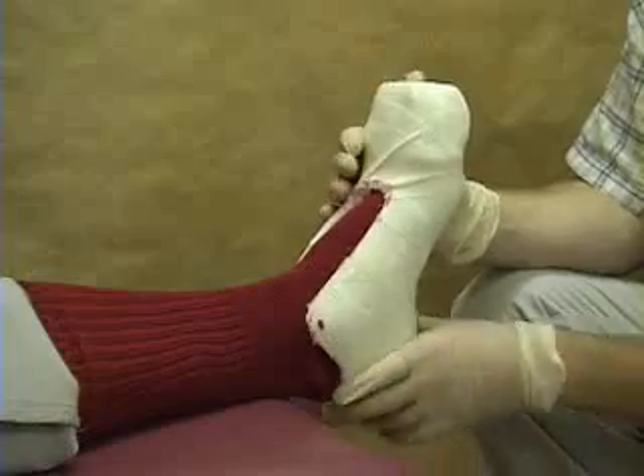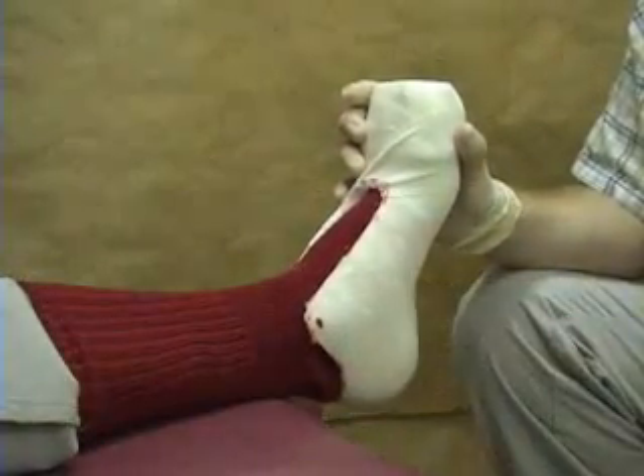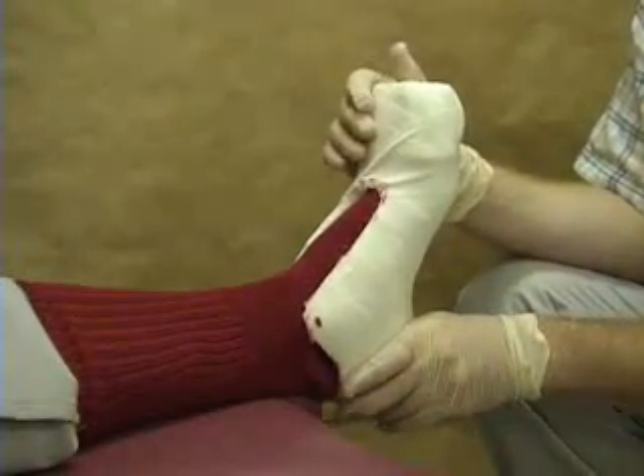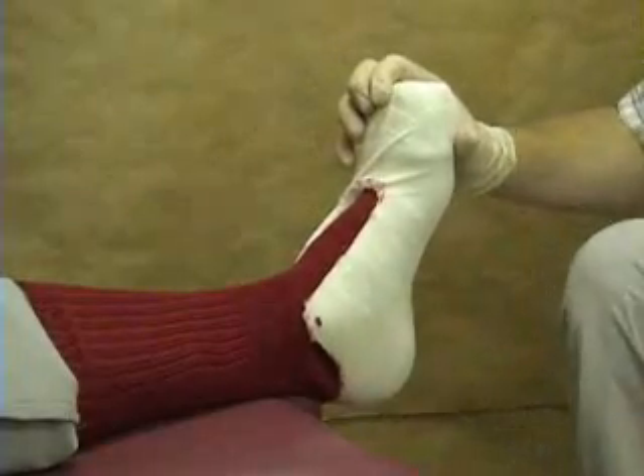This could be done when the subject is in for the first time, or it could be done later on after the posts are glued. In order to do that, we're going to use some of the same thermoplastic material that we used for the toe cap. We've got some here in hot water.